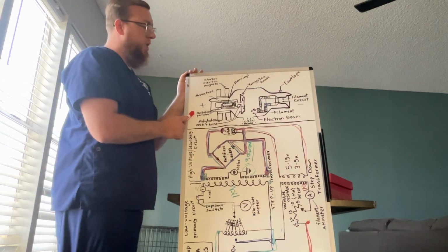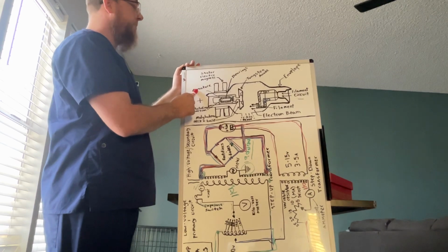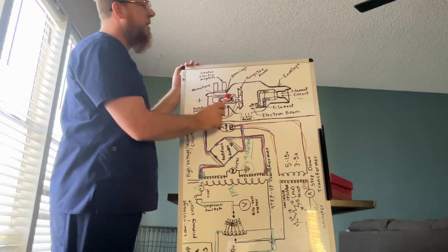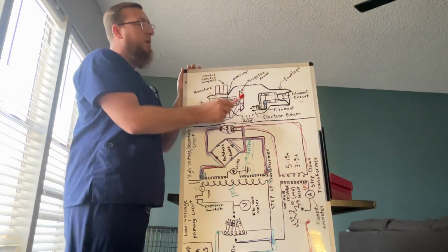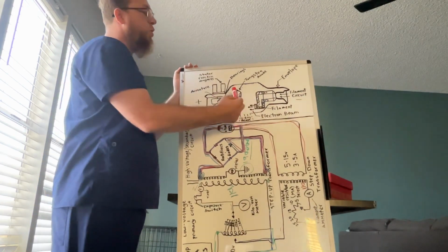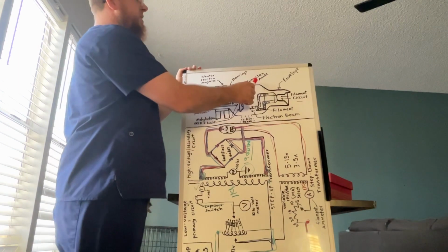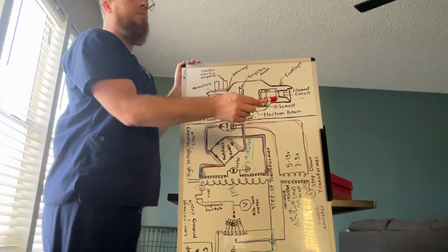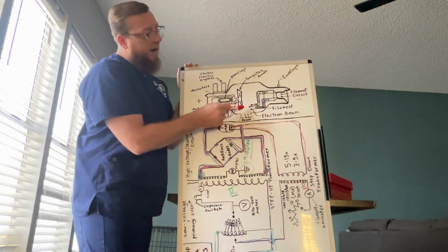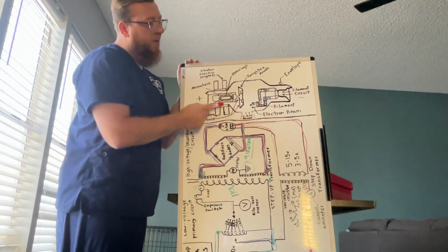Our rotating portion, our anode side, or our positive side, our armature, our stator electromagnets, our bearings, and our tungsten anode. Tungsten is a metal. It's used in the X-ray tube because it can withstand high heat. I believe it's 3,370 degrees Celsius.